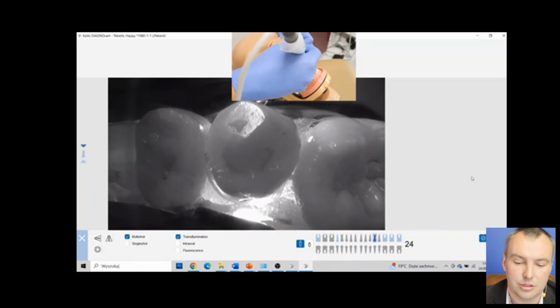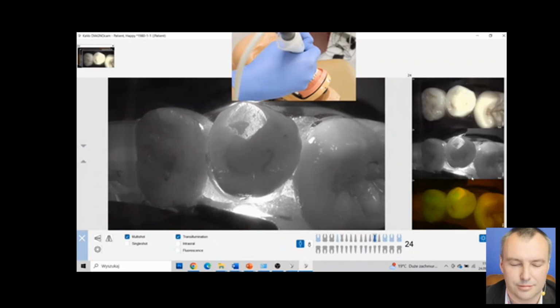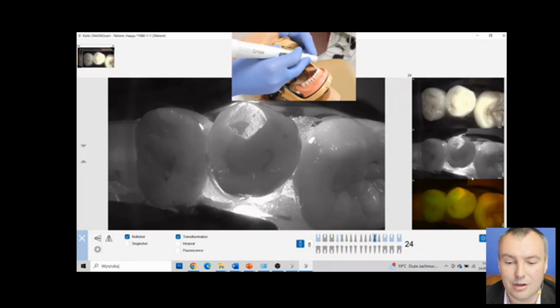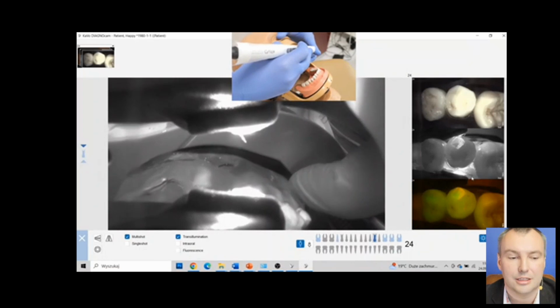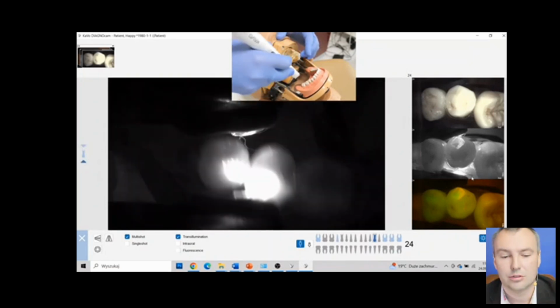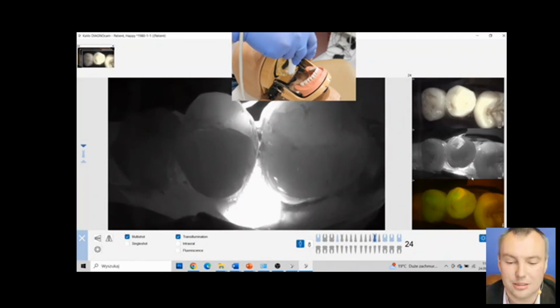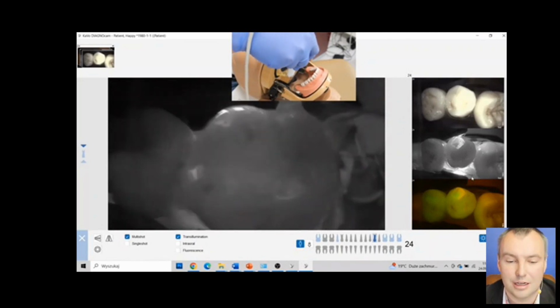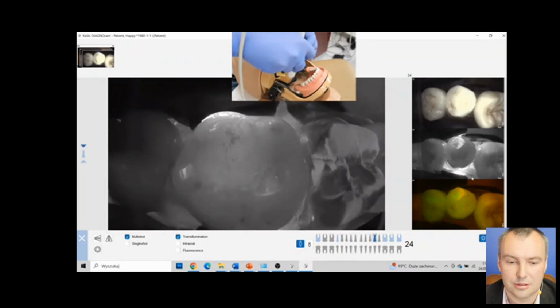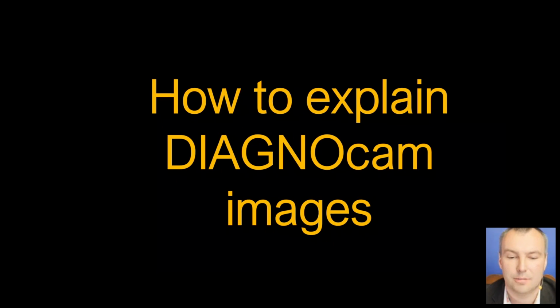And actually, it's more 2.5 than 2.4. My mistake, sorry. Okay, so I get 3 images at the same time. Then I press the play button to turn on the camera again. Okay, so this is the revision. We normally work like this.